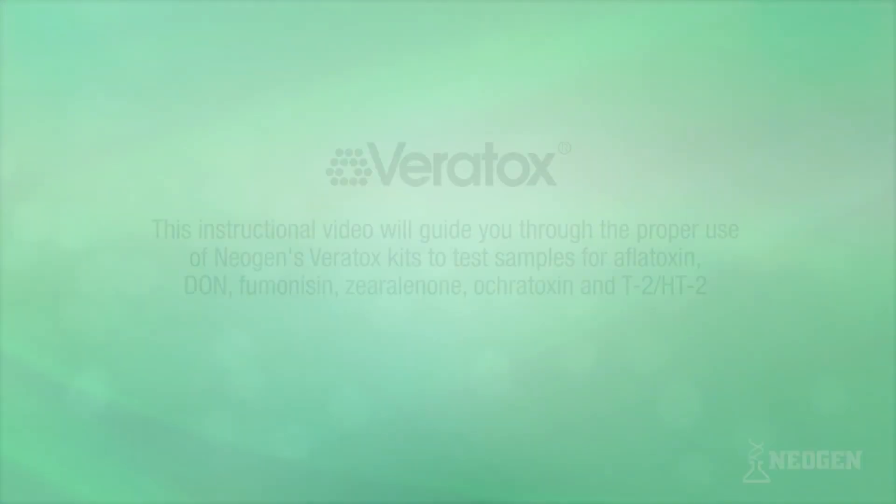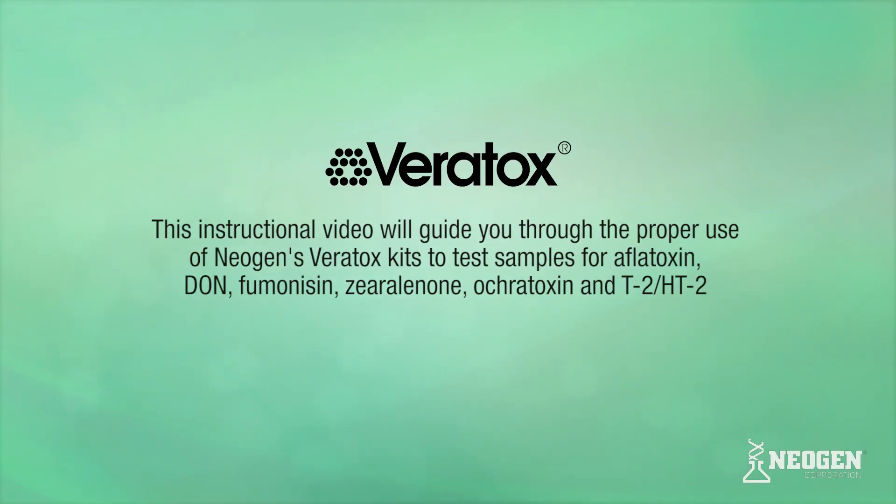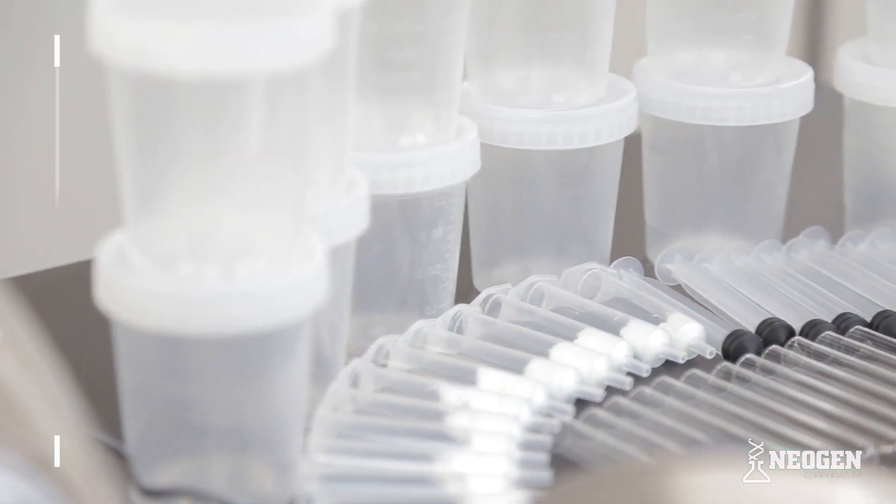This instructional video will guide you through the proper use of Neogen's Veritox test kits to test samples for Aflatoxin, DON, Fumonacin, Xarelonone, Ocratoxin, and T2-HT2.